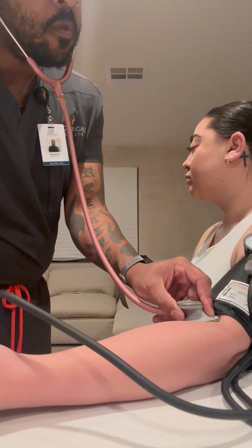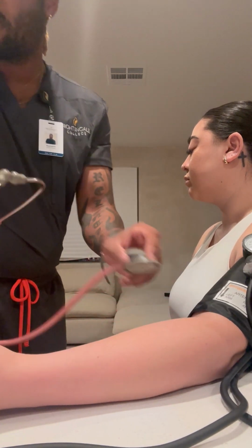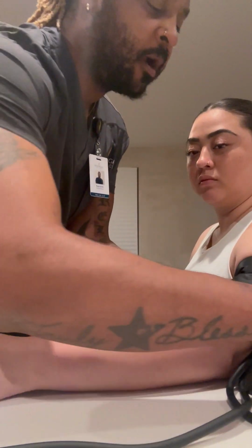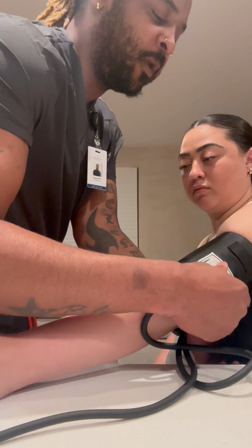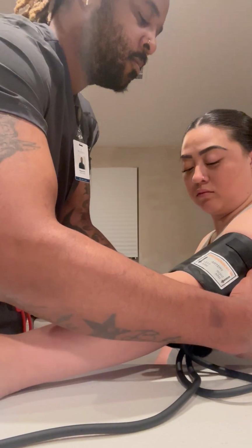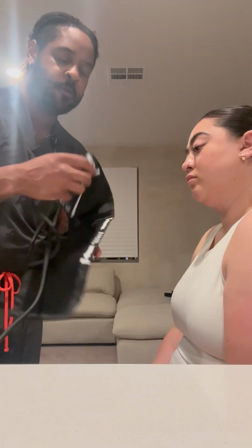Okay, so her blood pressure reading was 130 over 90, which is, her diastolic is a little bit higher than usual, but it's still within normal range for her. Okay, I'm gonna take this off. There we go. Okay.